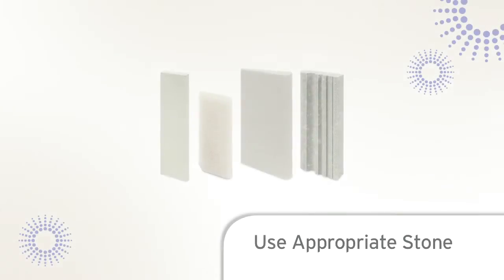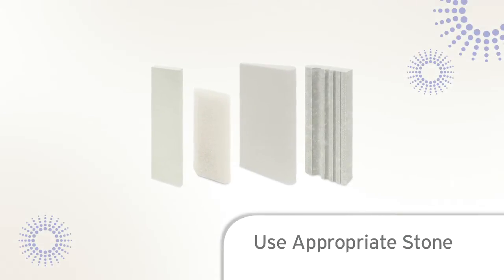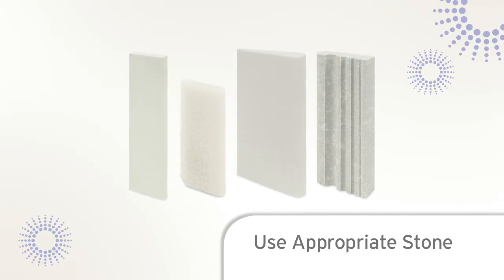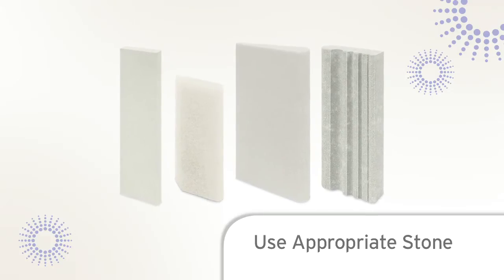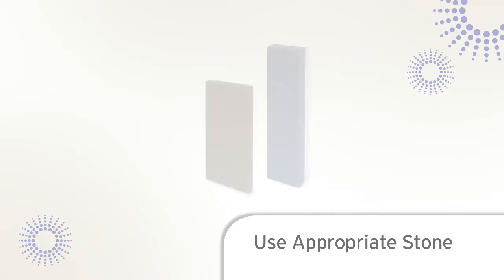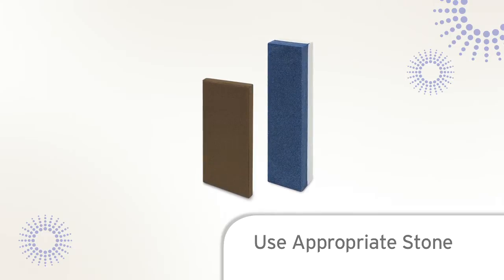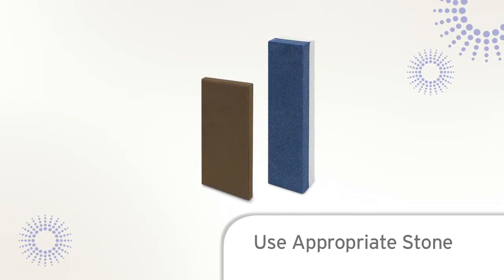It is essential that the proper stone is used to accomplish the sharpening task. Light routine sharpening can be accomplished with a stone that has a fine grit, such as an Arkansas stone. Instruments that are very dull will first require sharpening with a coarser stone to establish an edge and are finished with a finer grit stone.